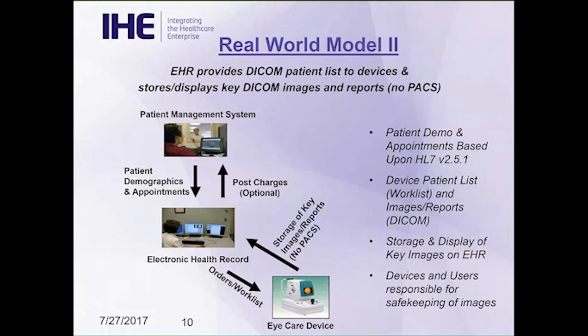And so in this model, your EHR takes the ownership now of actually storing and displaying the key images and reports generated by all your different devices. So what's happened now is your EHR has raised the bar relative to their DICOM capabilities and now can actually store and display DICOM data. However, there's one key point here. Your EMR is not an archive.